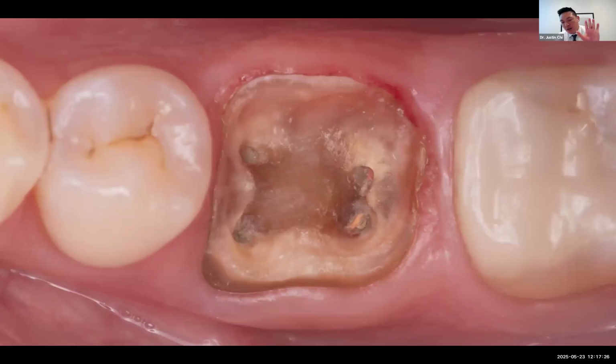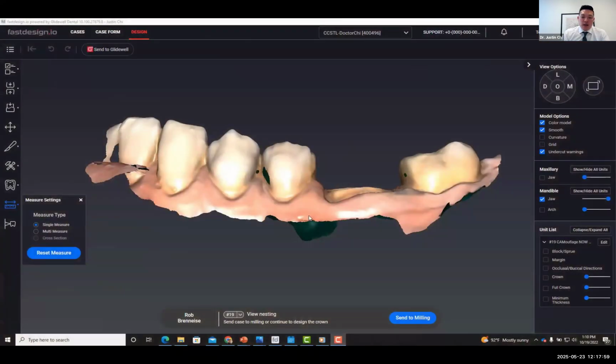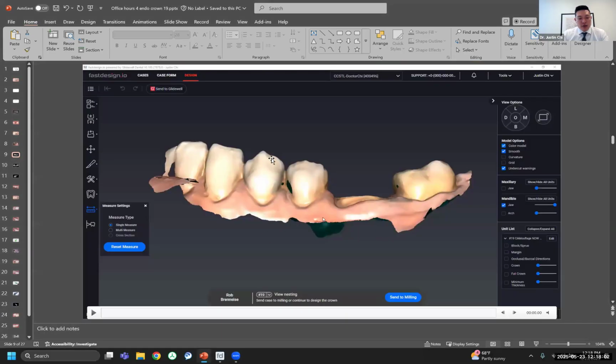So anywhere there are vertical areas of your preparation, you can think of that zone as like a traditional crown prep. You can see here on the distal lingual area, the margin is getting really, really low. So any areas where you notice your prep really going subgingival, you probably want to bone sound and just verify that you're getting into a safe space, still within the safe biological width zone, about 2 millimeters. All right, so I have a video of the design, but I'm going to show you the design here.